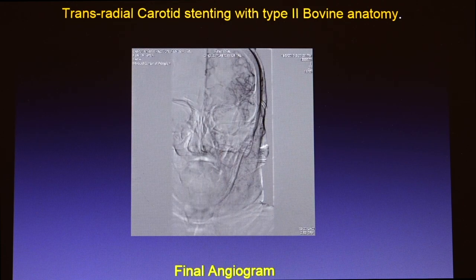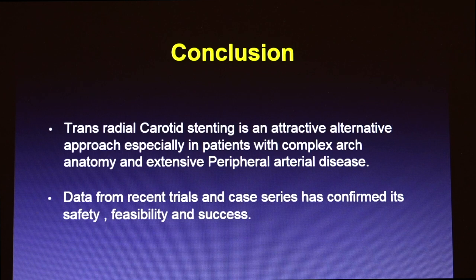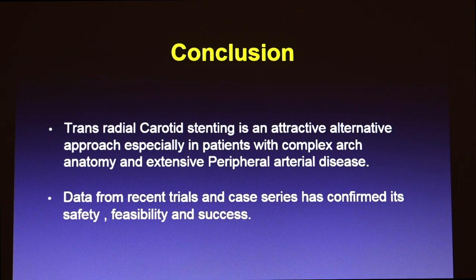We post-dilated the stent using a 6.0 balloon and had pretty good results at the end. You can see most of the filling now is happening from the left carotid artery — you can see the preferential filling of the M2/M1 component, and it started to fill the midline as well. The patient did very well. The entire procedure from radial artery stick to stent deployment and catheter withdrawal was within 25 minutes. The filter time was close to 9 minutes. As you know, filter time greater than 15 minutes carries a higher risk of periprocedure stroke. The takeaway is that carotid artery stenting can be done through the radial approach, particularly for patients with a complex arch or severe calcification, as longer catheter manipulation in the aortic arch increases stroke risk.